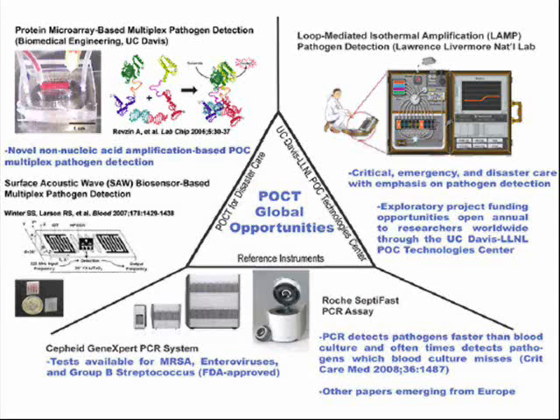When these antibodies, specific for a target, let's say HIV-1, bind with the antigen, their mass is altered, thereby causing a phase difference in the wave, and this is detected by the sensor. Essentially, this biosensor serves as a very sensitive mass detector. Currently this device is intended for emergency blood donor screening. So in a disaster situation, you would use this to screen donor blood so that you won't give someone a blood-borne pathogen. In this case, this biosensor is set up to look for HIV 1 and 2, hepatitis B virus, and hepatitis C virus.